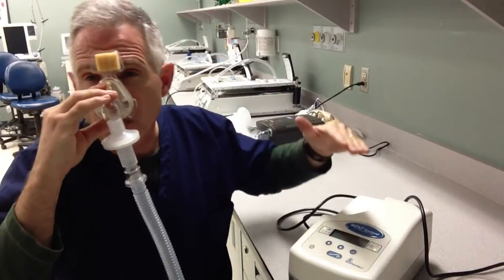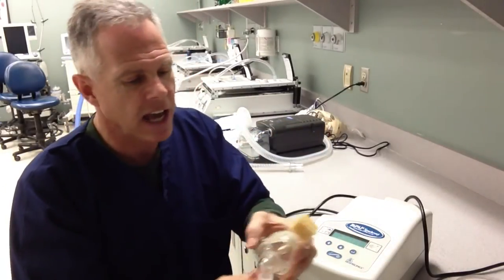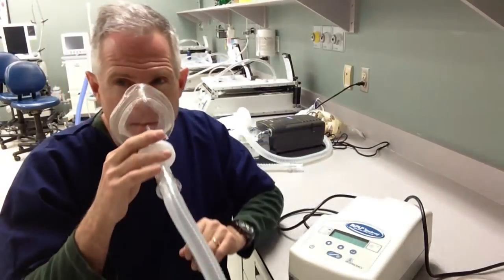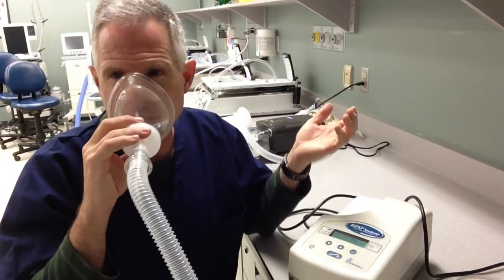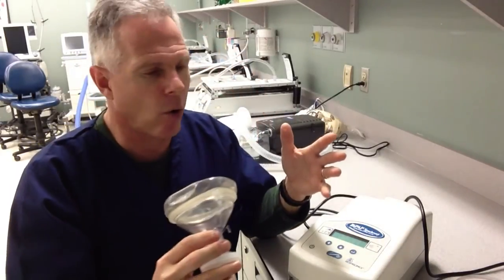If there's a problem and the patient can't breathe through their nose, then a nasal mask would be a poor choice. We may go to something like the full face mask, like I've got here, and we can use the appropriate headgear to hold that in place.